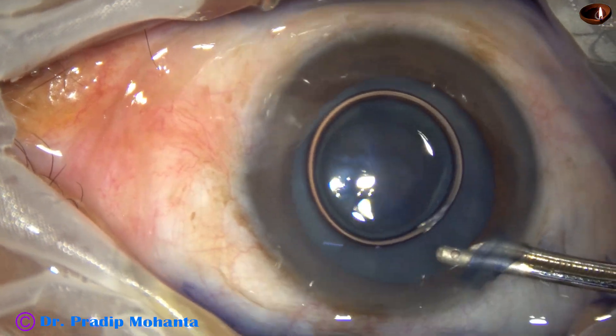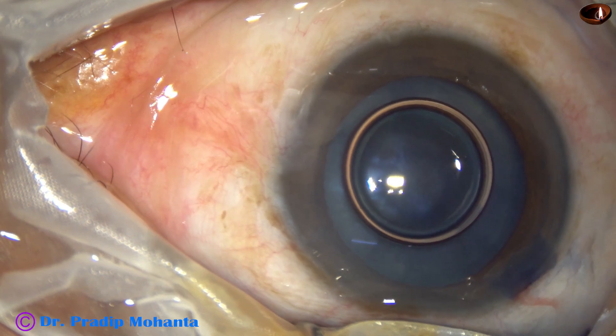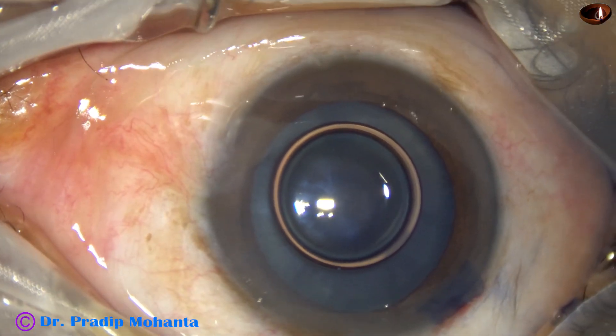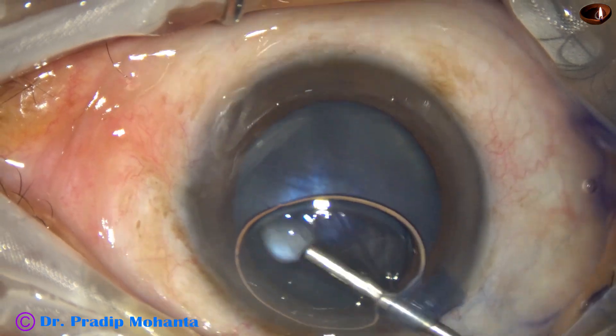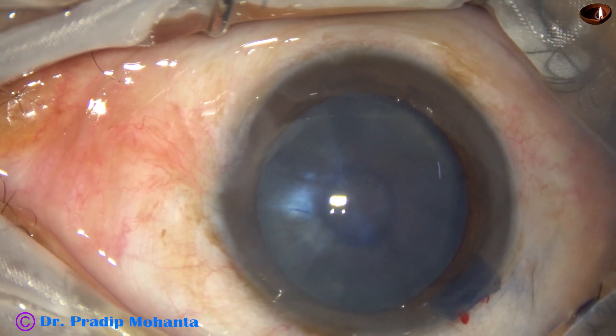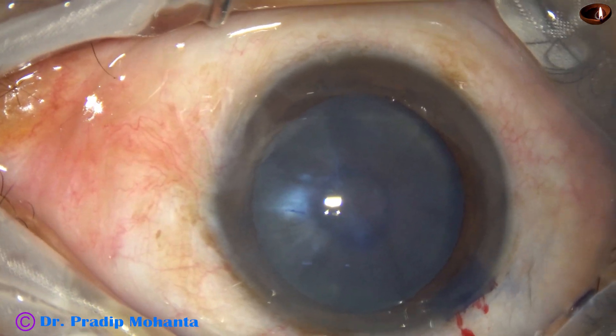I wash it out routinely because the anterior chamber is uniform. There is no higher concentration of dye at one place, lower concentration of dye at another place, which happens if we don't wash the dye.